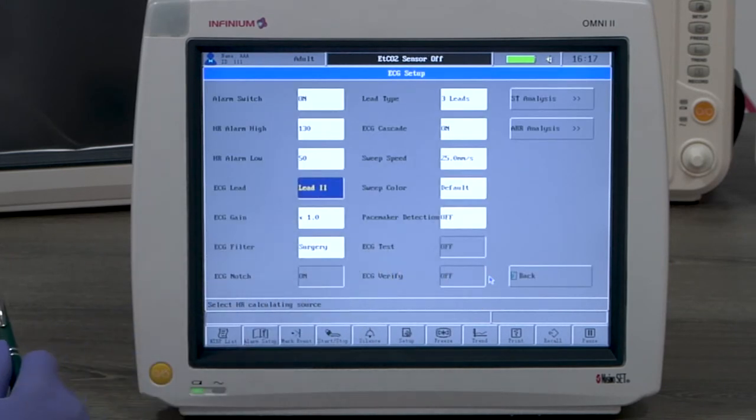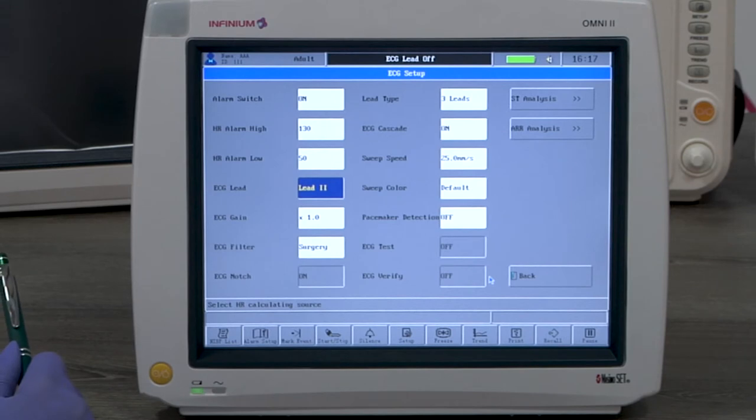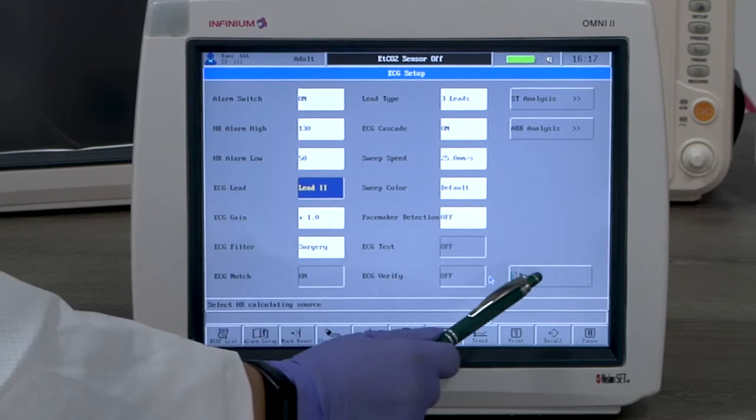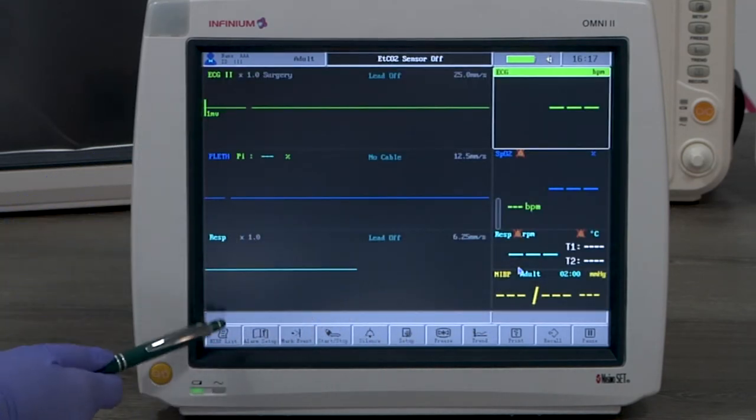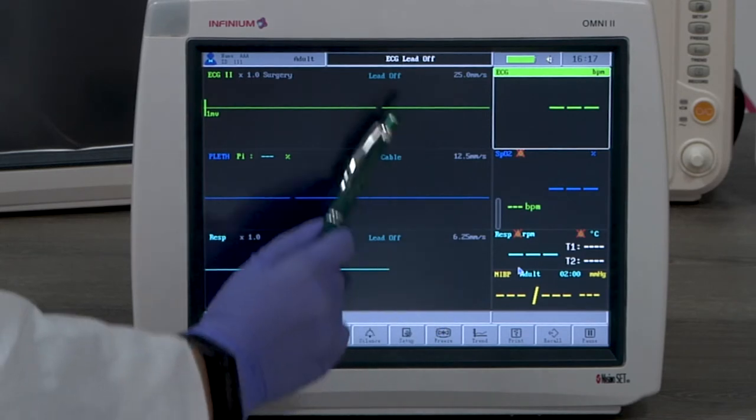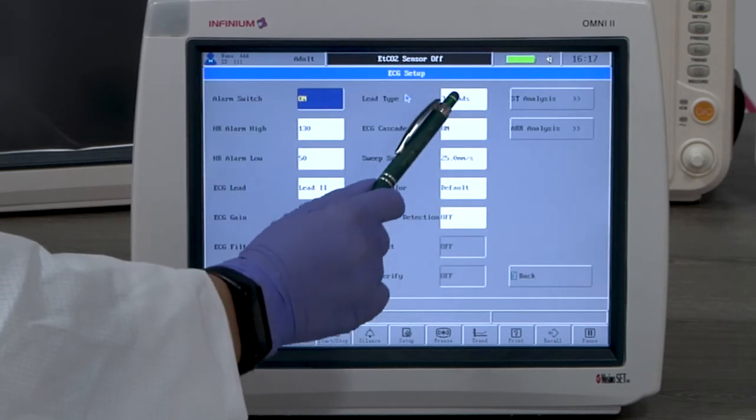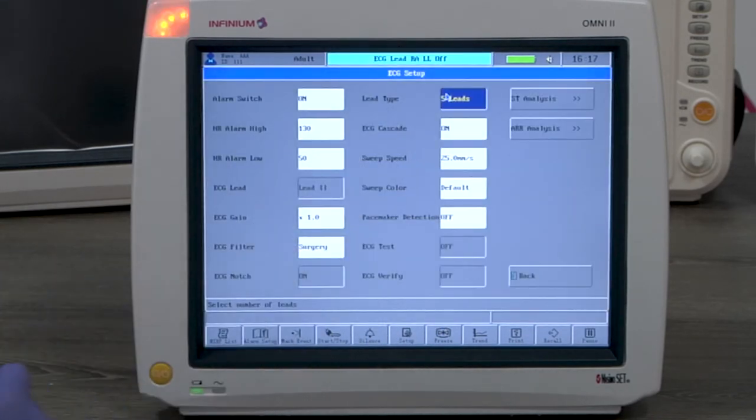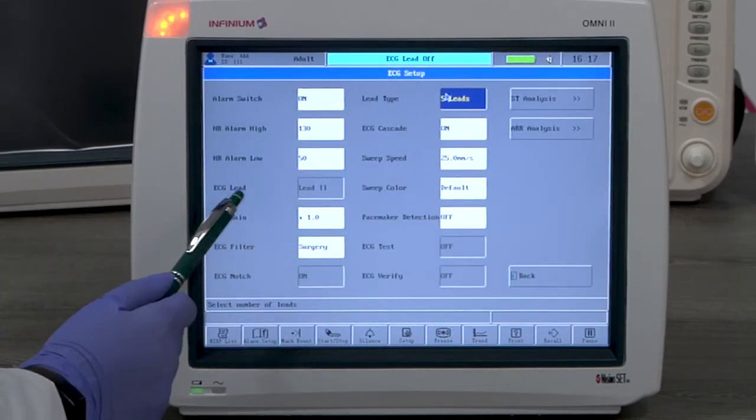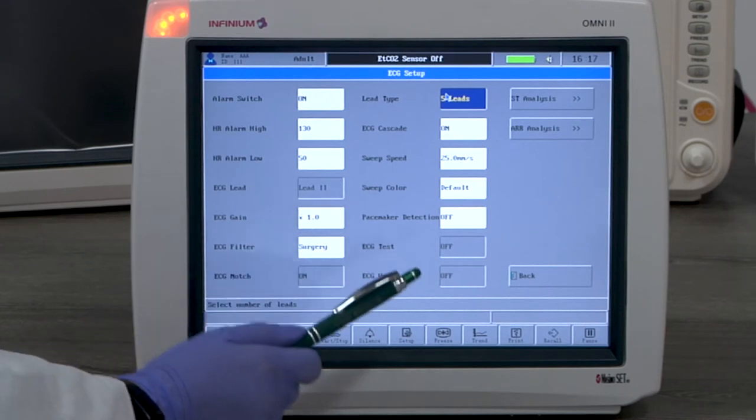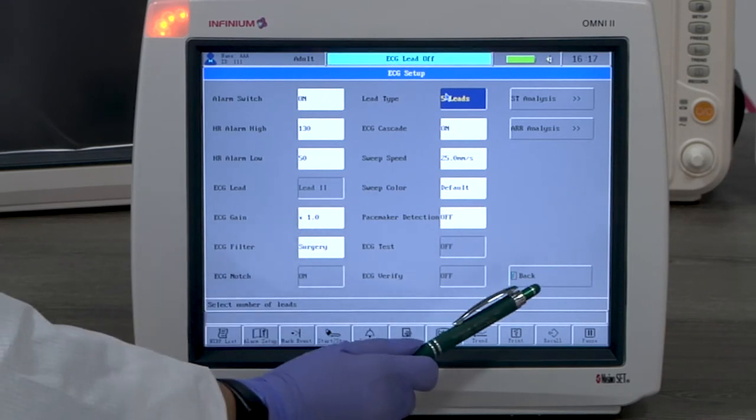The display mode will also automatically be changed to a 3 channel display. When 5 lead is selected, the ECG lead option will not be available for selection since all leads are available to be displayed.